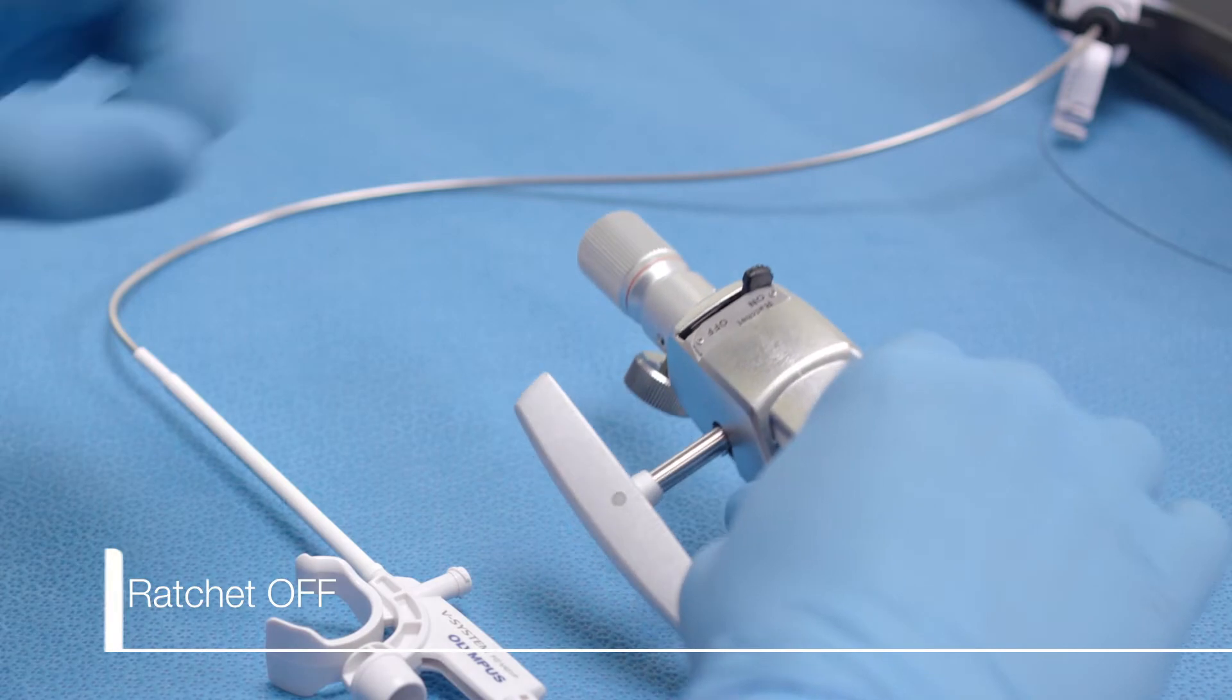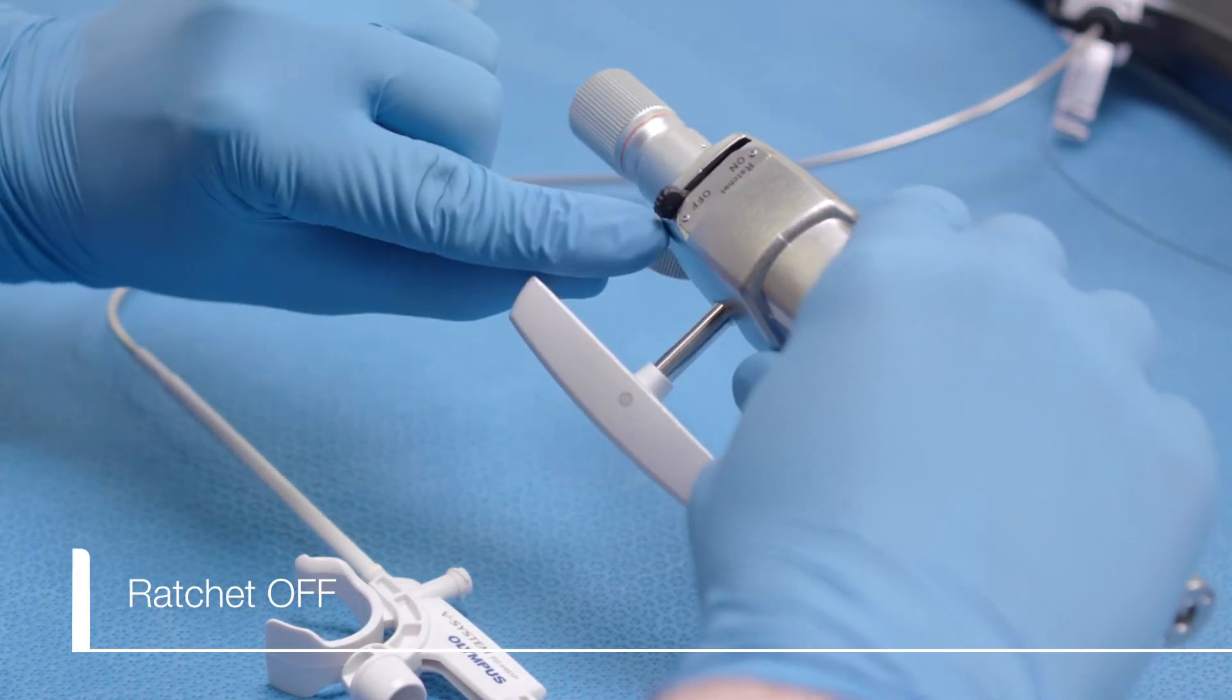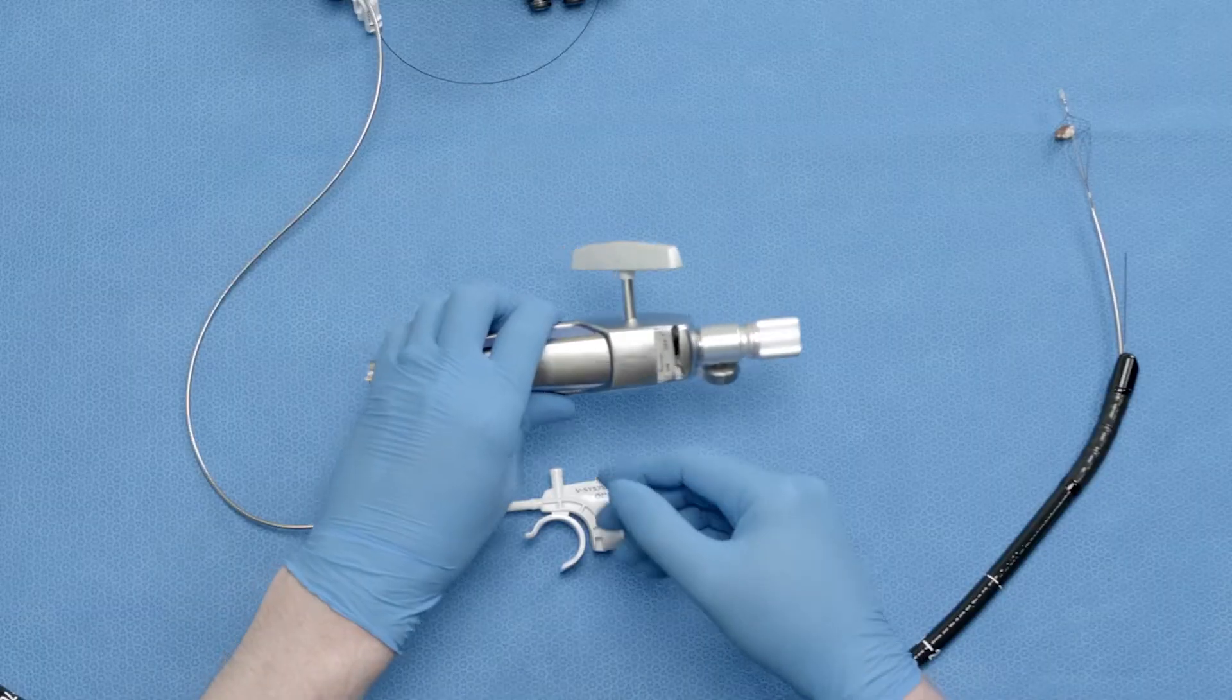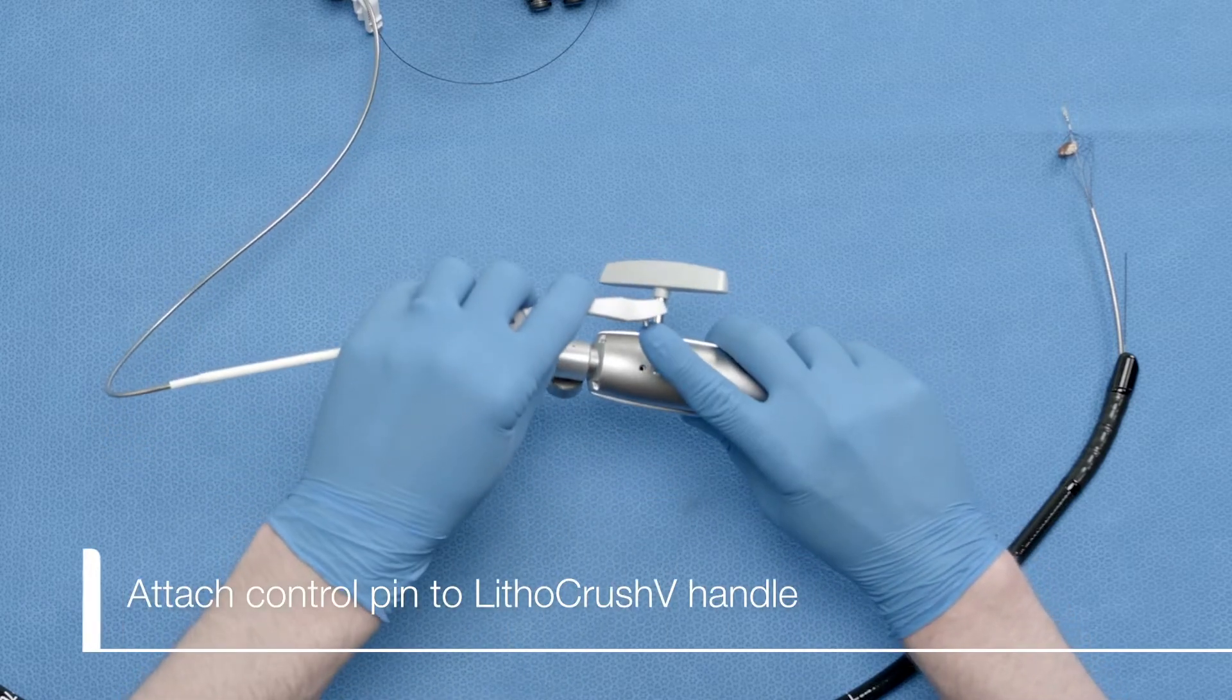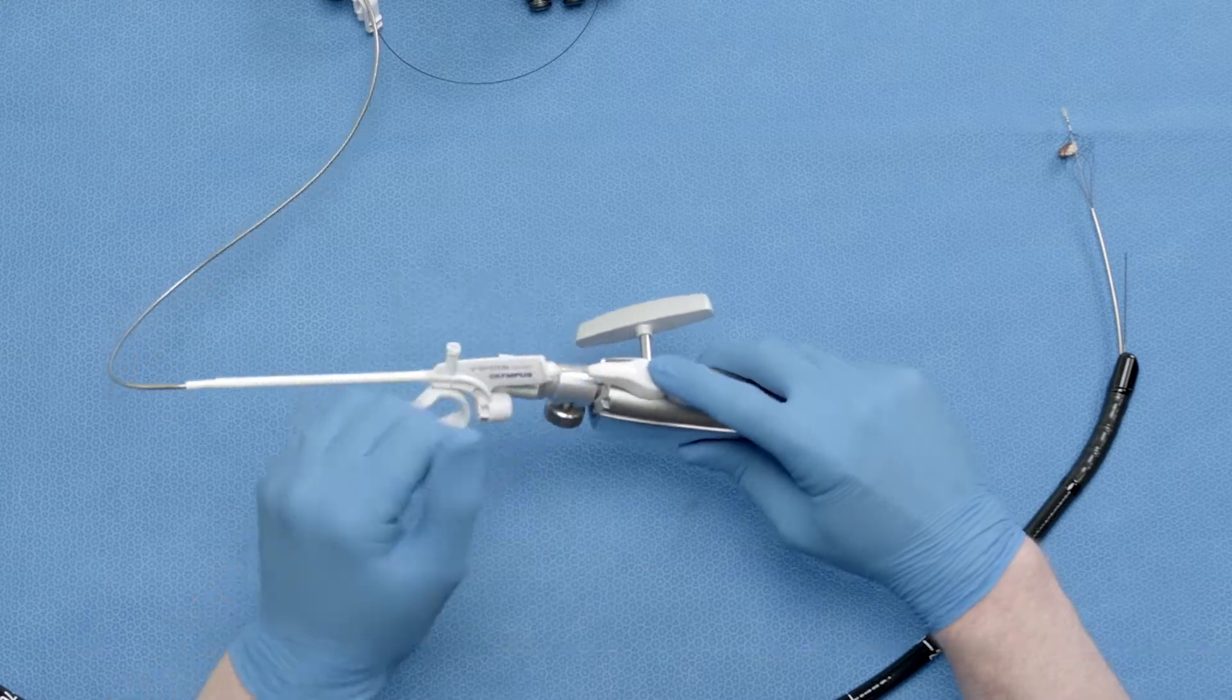Let's start with the Lithocrush V Handle. Push the ratchet switch into the off position. Seat the pin on the control grip of the VortiCatch V Basket into the hole on the underside of the Lithocrush V Handle.